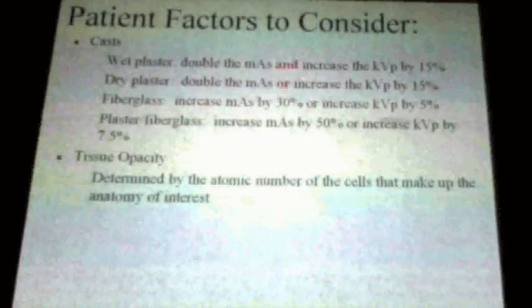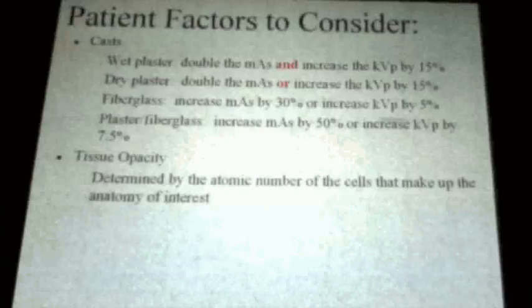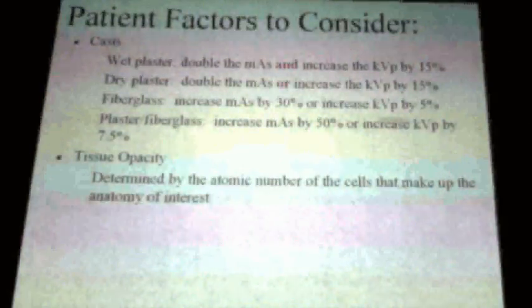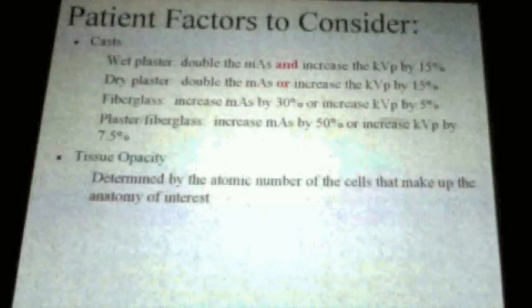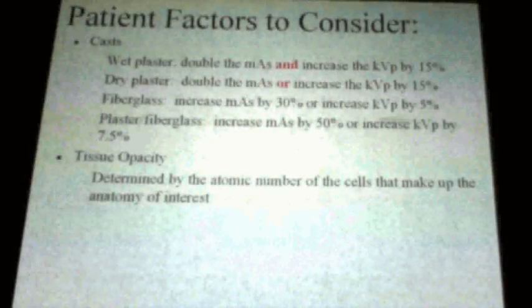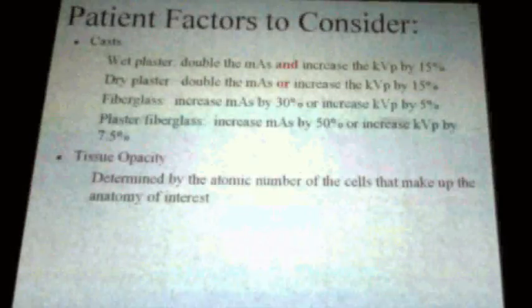It absorbs the primary beam evenly across it. So therefore you don't see it, and the table doesn't show up. So if I was to ask you in the quiz next week, why doesn't the table show up on your image? The answer is because it's the same thickness and it has the same Z number, the same atomic number throughout it.